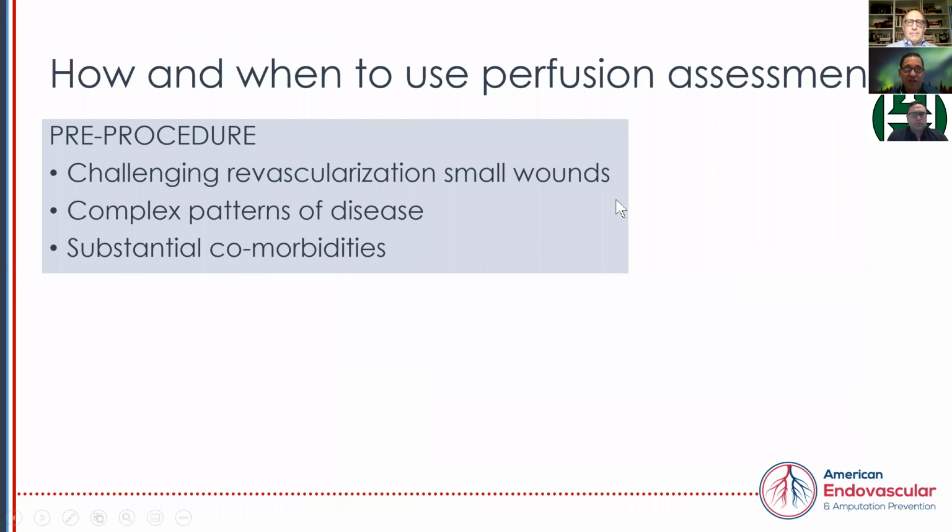we've revascularized. And Dr. Shams, did you say that's one of your goals, to try to achieve that wound blush? Absolutely. I think once we see the blush, that convinces us that we have the vessel that we need to treat, and we need to get flow going into it so that we can heal this wound. So I think it's really important for us.